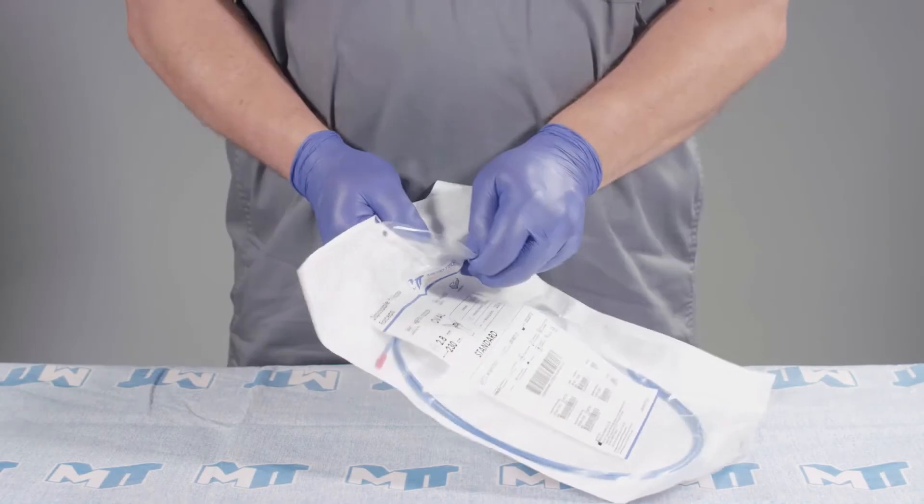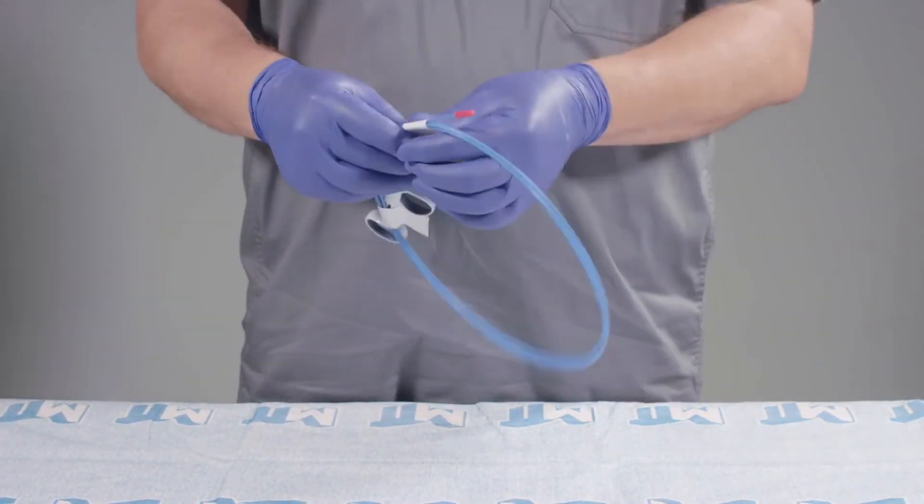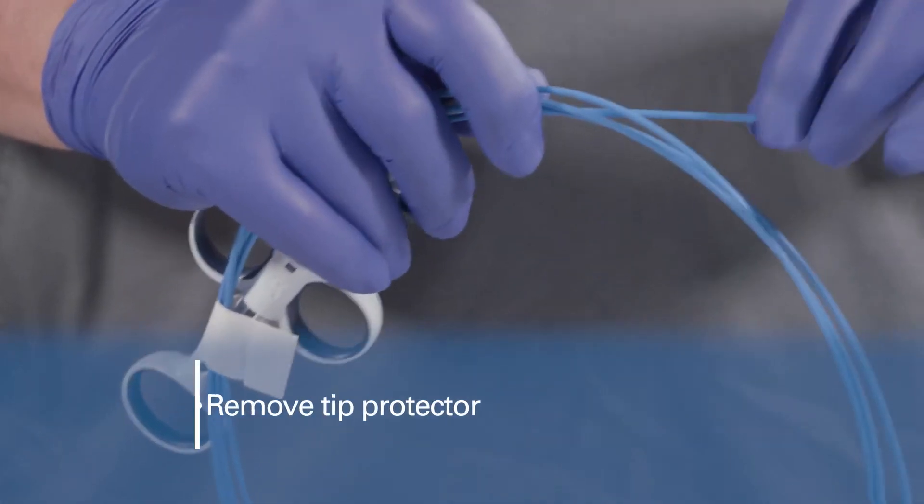Open the pouch and carefully remove the hot biopsy forceps from their packaging and uncoil. Then remove the tip protector.